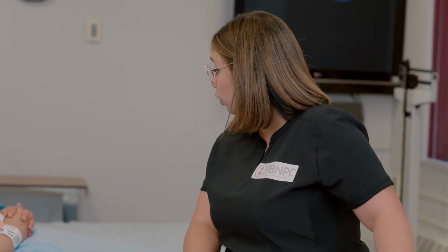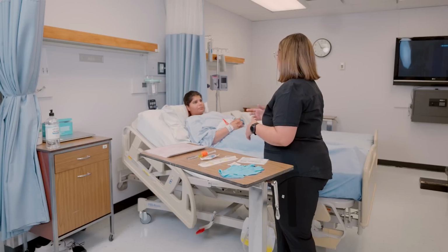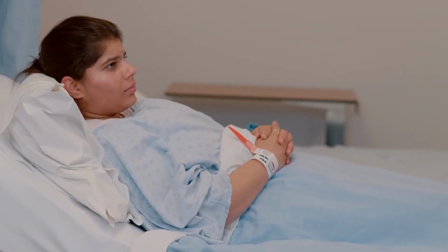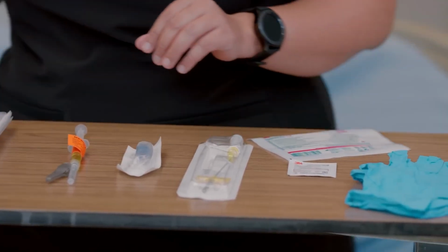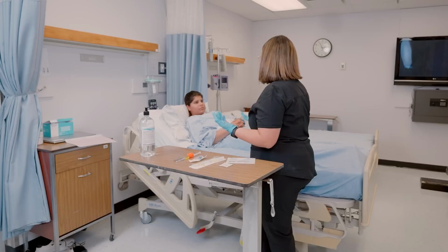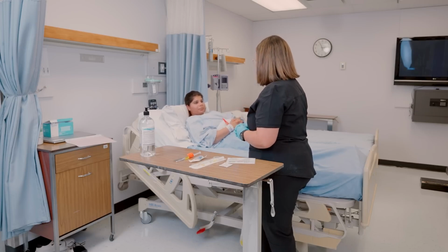Let's review the procedure. Before you begin, please ensure you have physician's orders. Explain the procedure to the patient and answer any questions they may have. Gather all your supplies, perform hand hygiene, and don clean gloves. Also ensure that your patient is comfortably seated and well informed.